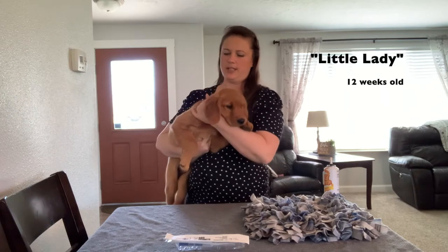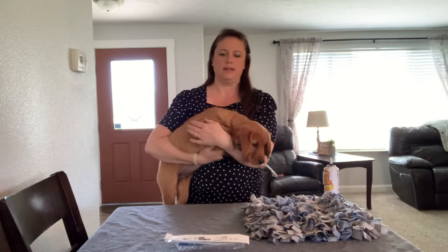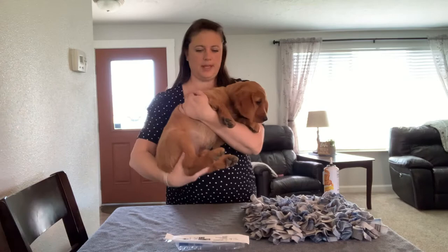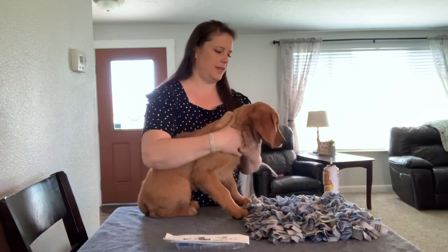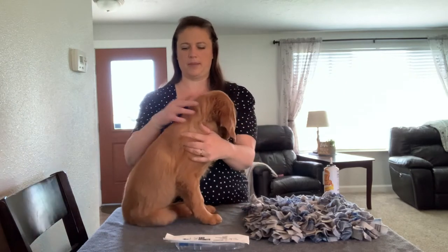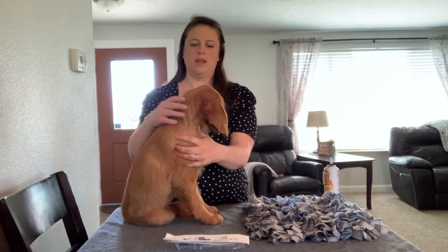This here is Lady and she's 12 weeks old. We usually microchip our puppies before they head to their new homes around eight, nine, or ten weeks. It's pretty rare that they cry — we usually don't have puppies that get very upset. They hardly notice, even though it does seem like a pretty big needle. It really doesn't seem to bother them at all.